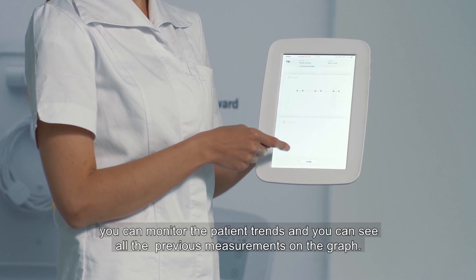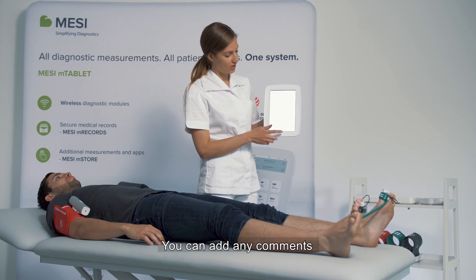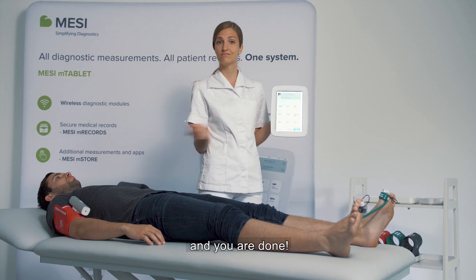You can monitor the patient's trends and you can see all the previous measurements on the graph. You can add any comments and you're done. In a minute!